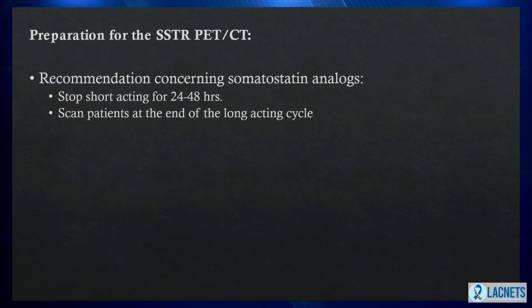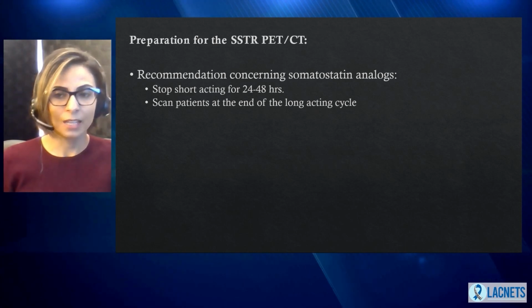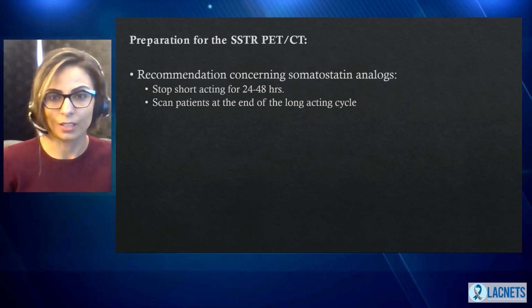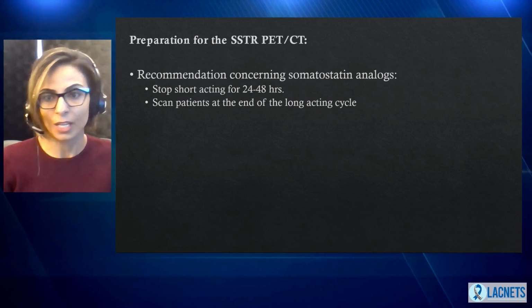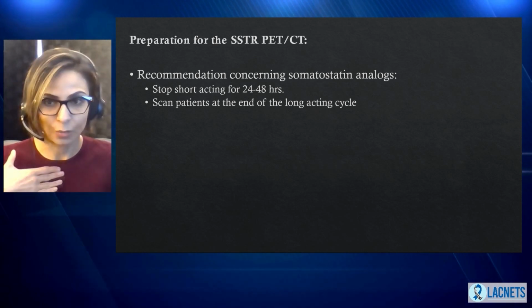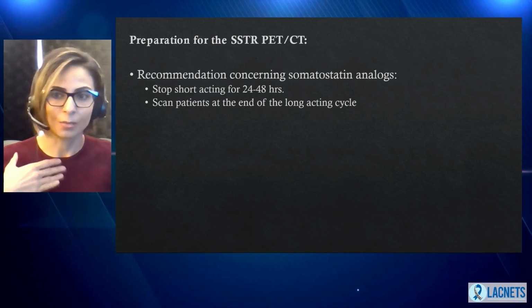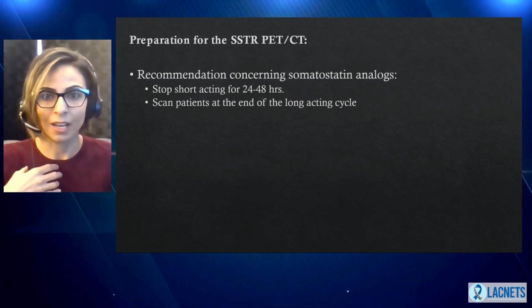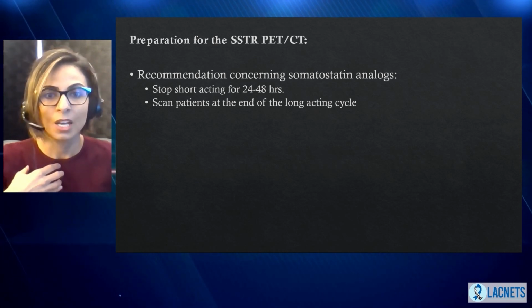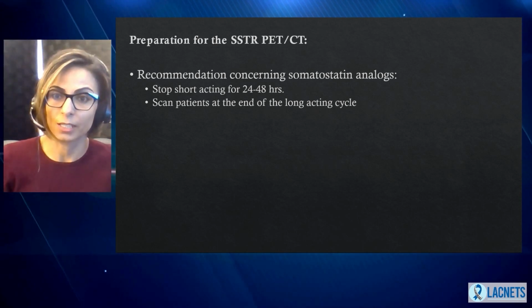Now, if you're a patient considering whether you should get a copper dotatate or a gallium dotatate, there is really no major difference. Just get whatever is available near you, it'll do the job. So clinically, they're considered equivalent. For us, as physicians who perform these images, we have to optimize our protocols for copper, which is something we talk about quite a bit, to allow good quality images with copper, which is a little trickier than gallium. But from a patient or referring physician perspective, there shouldn't really be a difference.